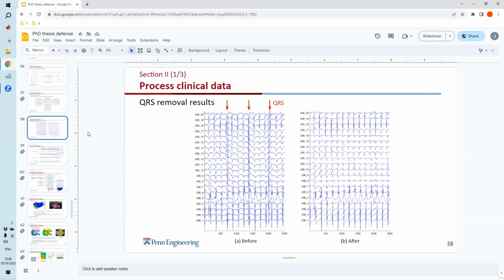So this is an algorithm implemented not on just one electrogram, but on 20 electrograms as a set. For example, this is the mapping catheter that contains the 20 electrograms. Why do we do that? In order to subtract the far field, the ventricle signal is one kind of far field signal. When it's far field, all the local regions will pick it up similarly. So that's why the first step is to subtract a median of these 20 electrograms. That actually does a lot of the work already.